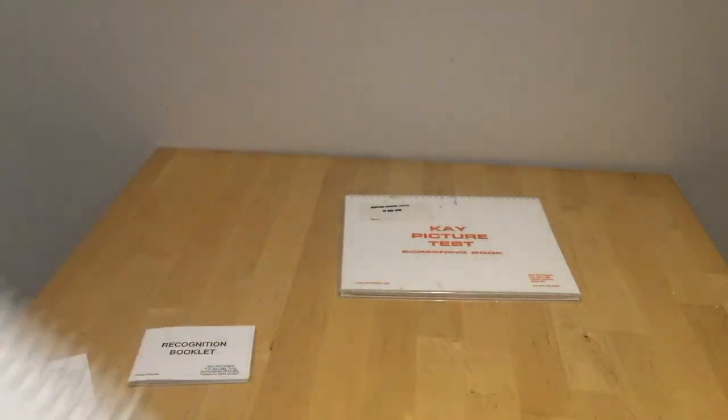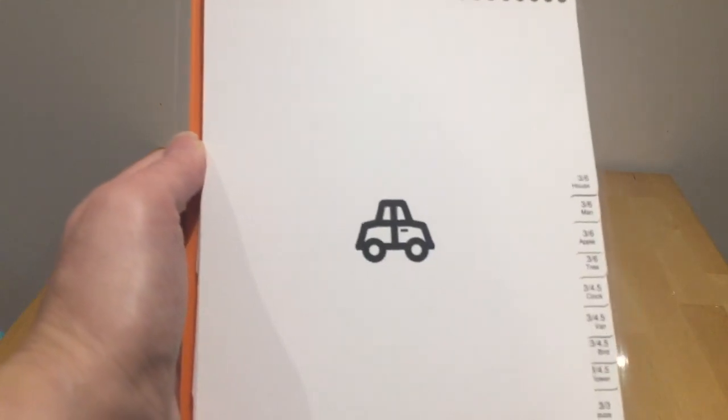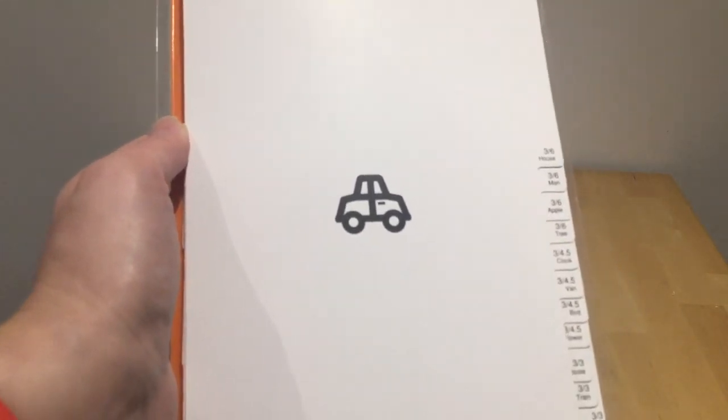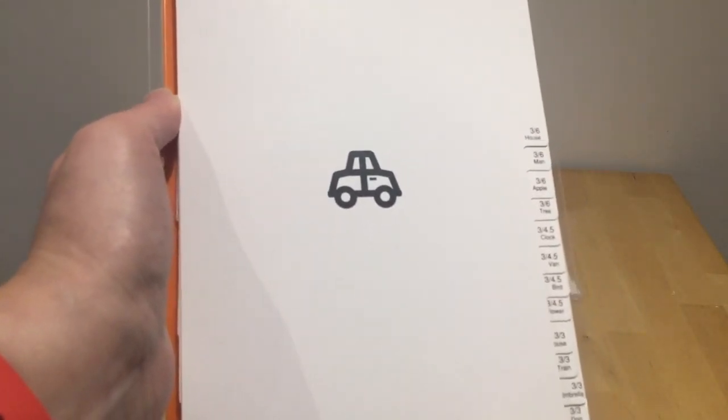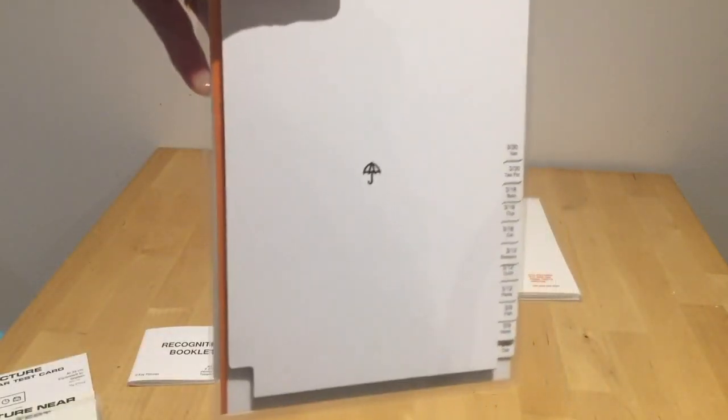Same as last time, you get to the bottom, turn it round, and it goes smaller: 3/6, 3/4.5, and 3/3 at the end. And it's the umbrella, because it doesn't appear, but there we go, single symbol, 3 meters.